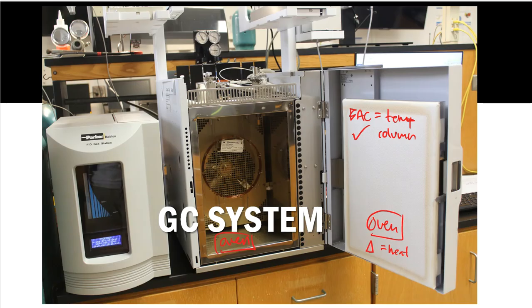Well, the column piece is actually, if I can do this a little bit better. I'm not sure if I can or not, but we'll see. Oh, that's not going to work. Look at that. Nope. All right. So right here is the column that's inside of the GC system.